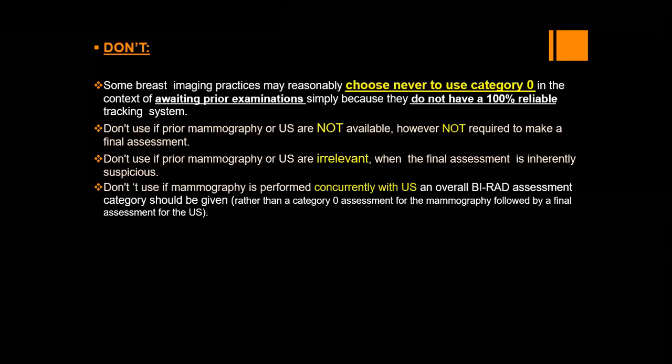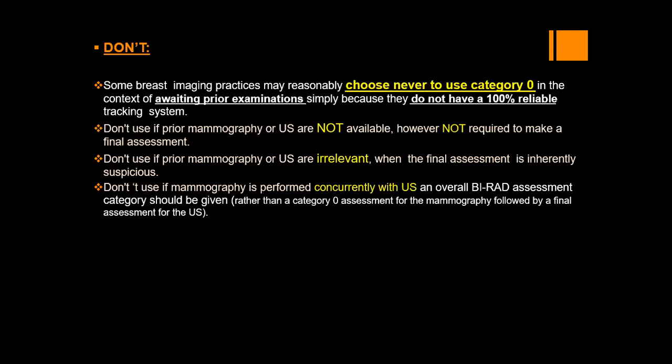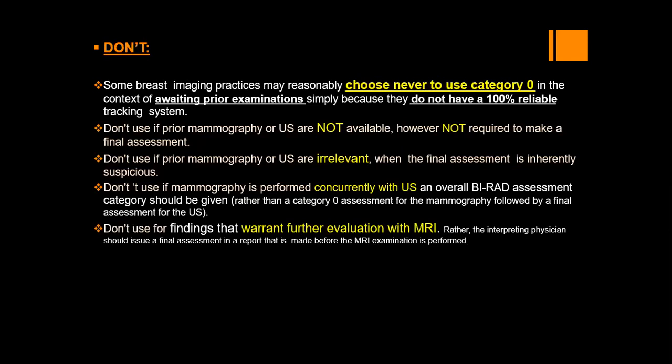Also, don't use BIRADS 0 if mammography is performed concurrently with ultrasound. So no need. We have to judge after ultrasound and give a final assessment category. We should not use category 0.